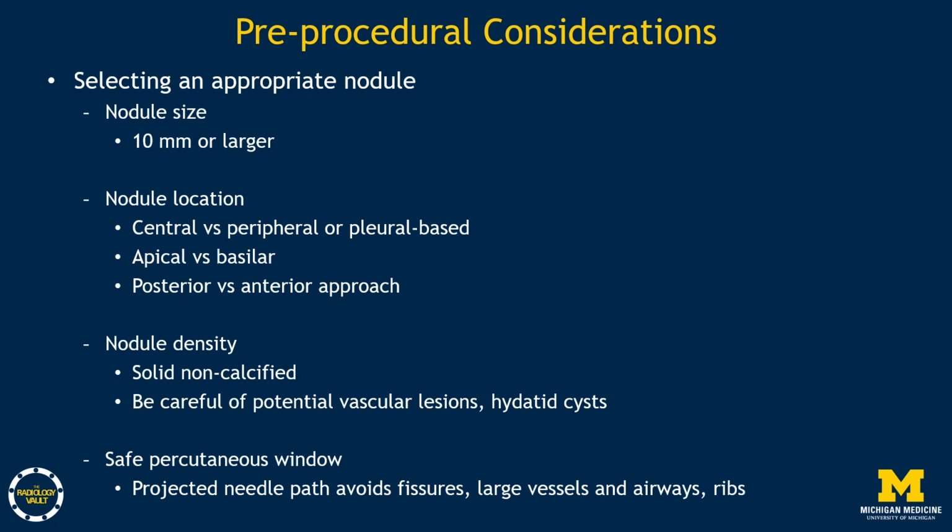Nodule density is also important, as a ground glass or subsolid lesion will be difficult to visualize during the procedure, which utilizes low-dose CT technique, thereby increasing the chance of a non-diagnostic sample. On the other end of the spectrum, lesions with prominent calcification are physically difficult to sample.